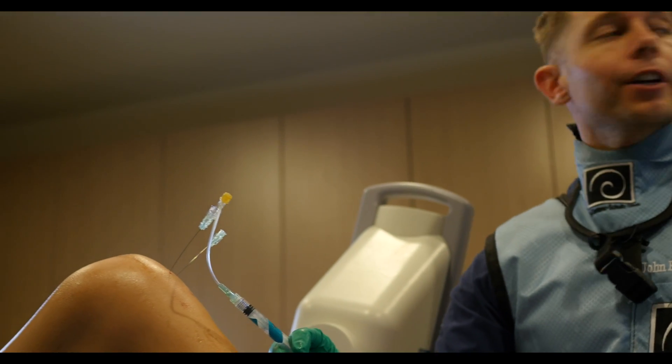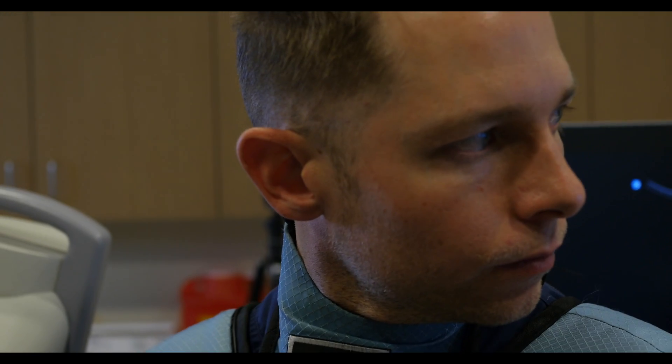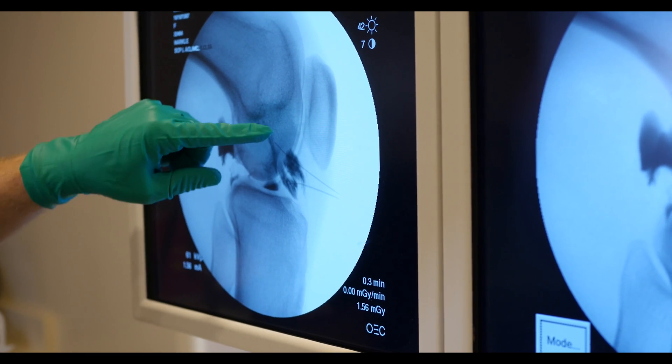With the contrast flow, I'm making sure I'm getting all those bundles. As I confirm placement, I put the platelets in with it, and I've got the origin and insertion covered.